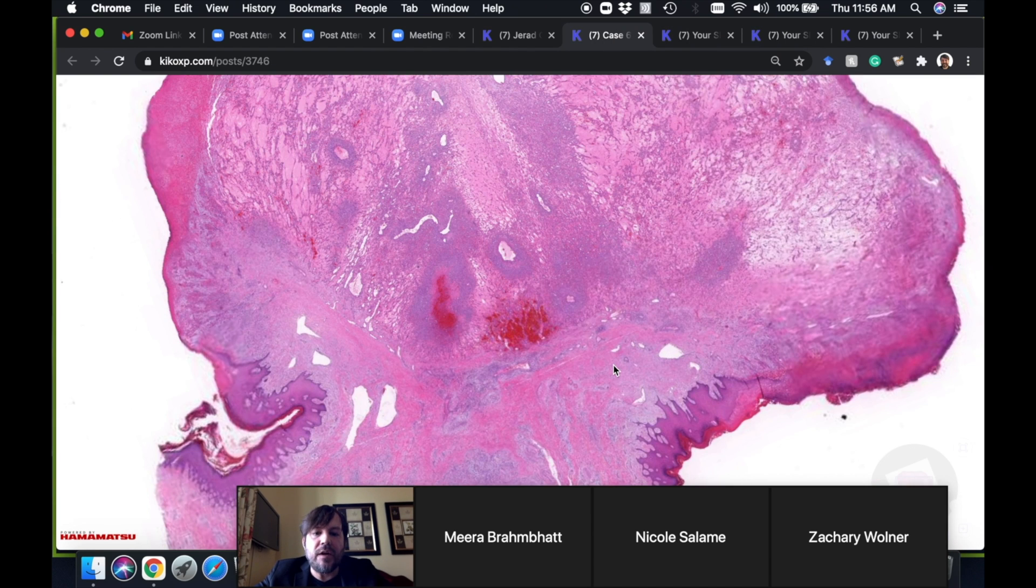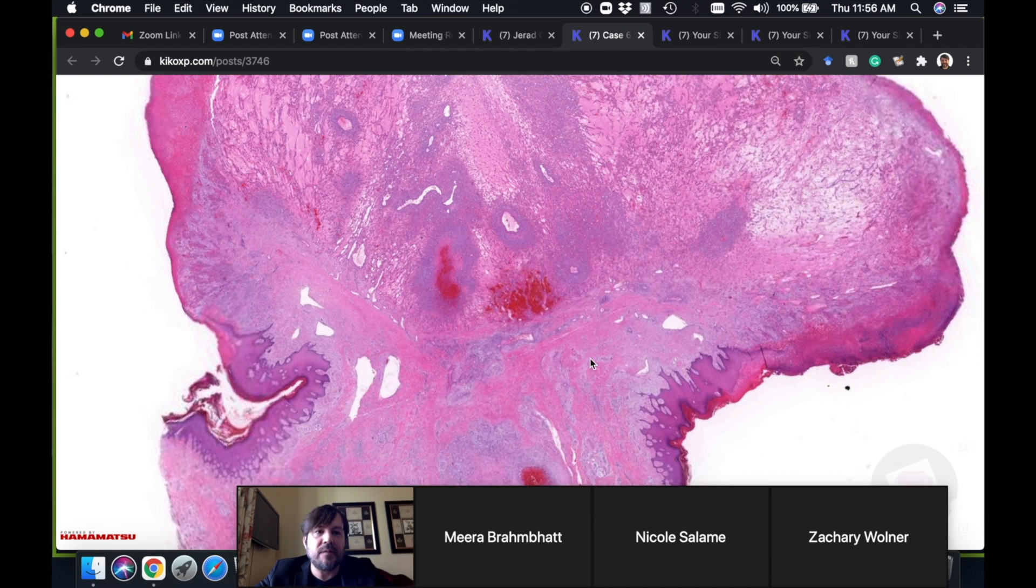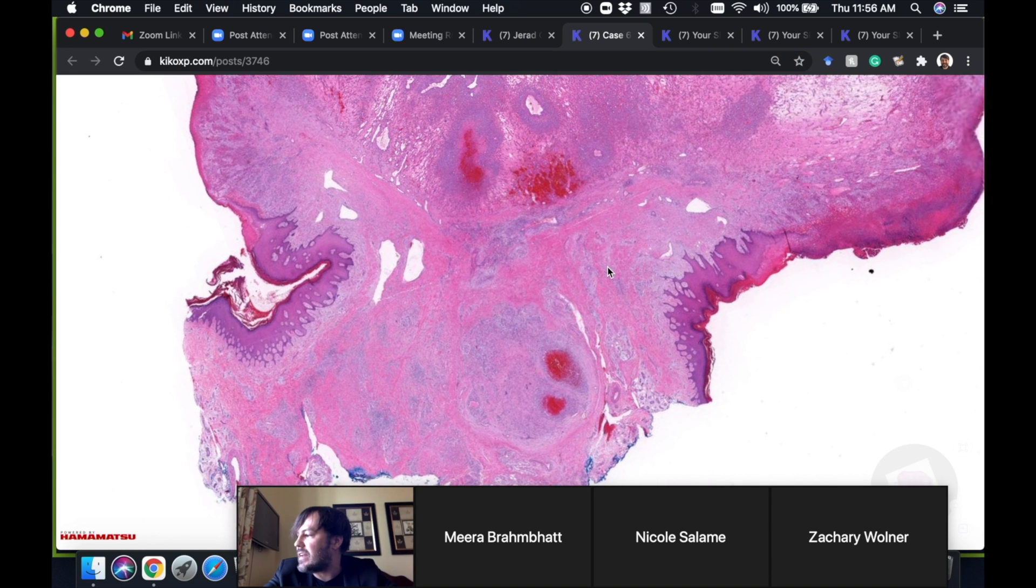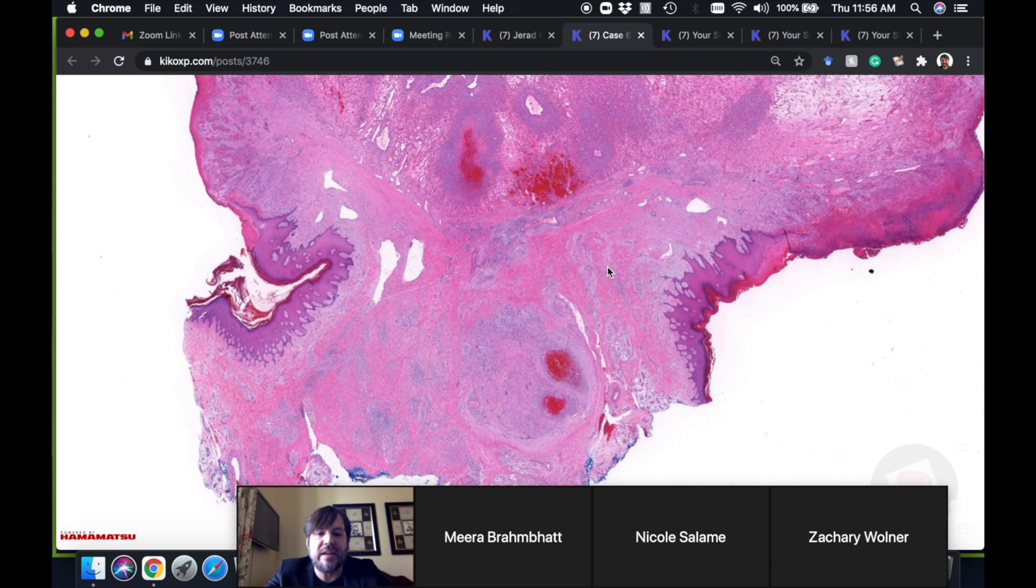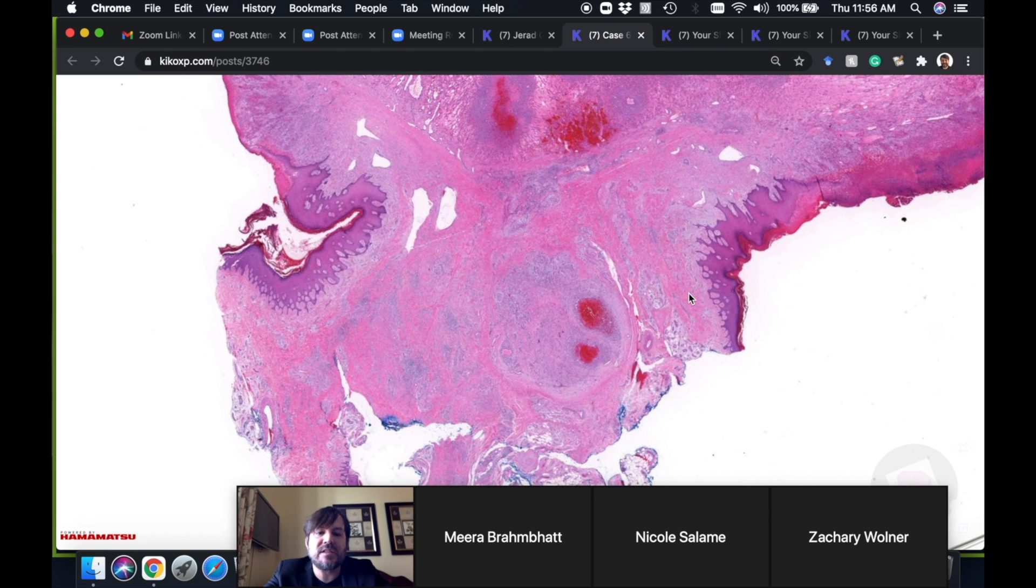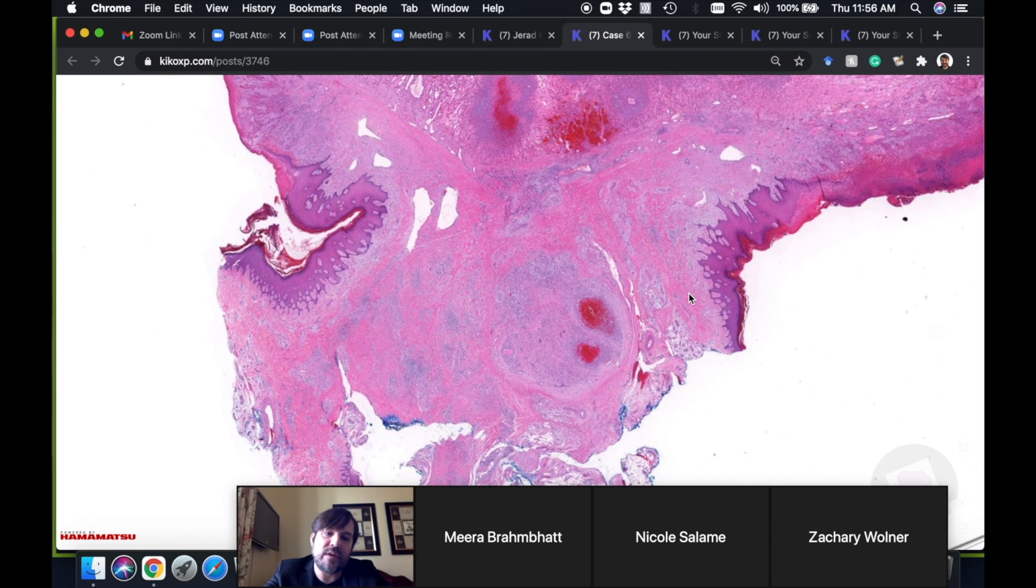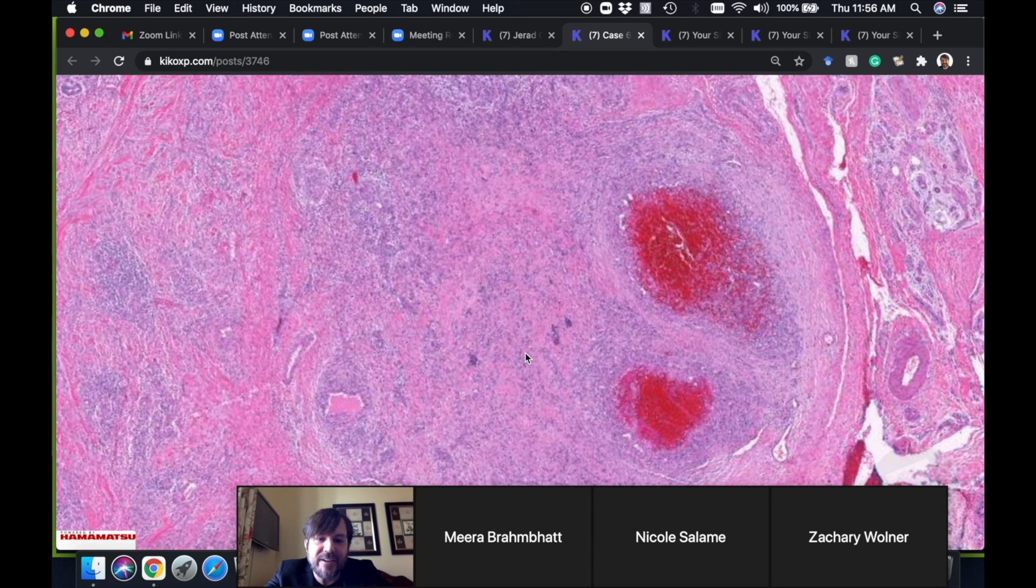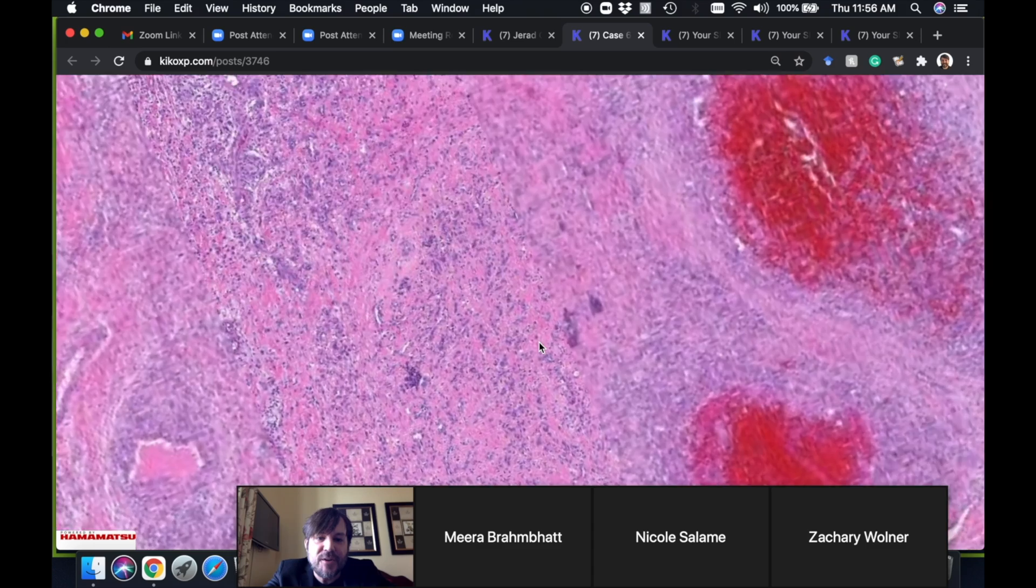Did anyone find—you can tell I like this case because I beat that to death—but did anyone find out what the bonus finding is? I said it was near the base of the lesion. Did anyone see it? It's pretty subtle.